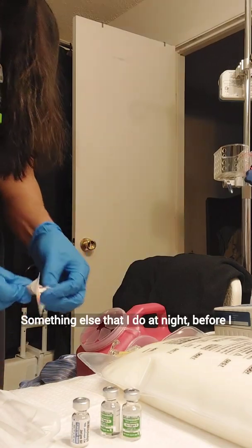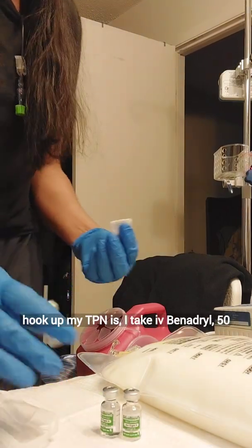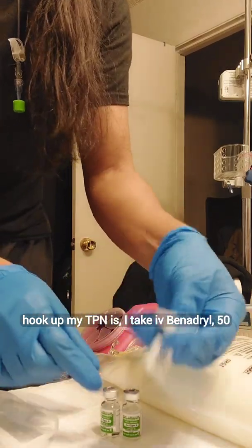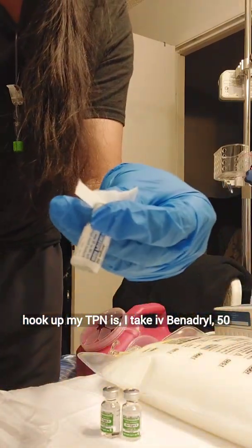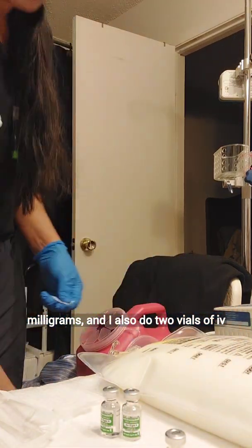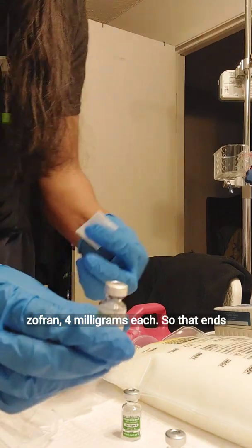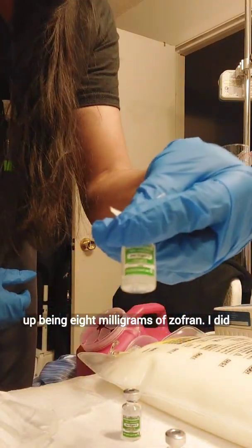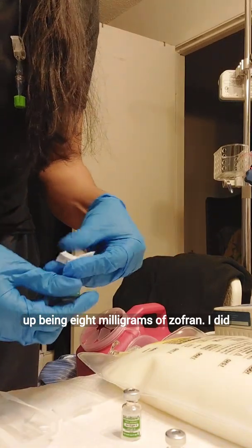Something else that I do at night before I hook up my TPN is I take IV Benadryl, 50 milligrams. And I also do two vials of IV Zofran, 4 milligrams each, so that ends up being 8 milligrams of Zofran.